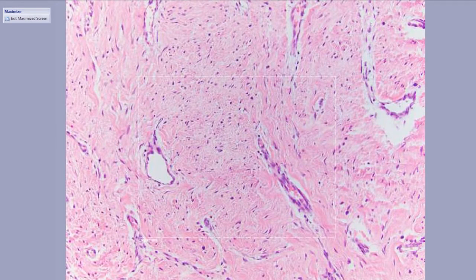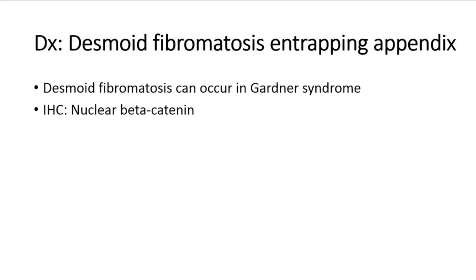And this slide serves not only to pull the appendix into this session, but to remind you that mesenchymal tumors involving the abdomen could secondarily involve the GI tract. One thing I wanted to mention, well-diff liposarcs can occur in the esophagus. They're extremely rare in the colon proper. I showed you that lipoma, but you could get retroperitoneal well-differentiated liposarcomas that then secondarily involve the colon, so you might see it in the colon that way.